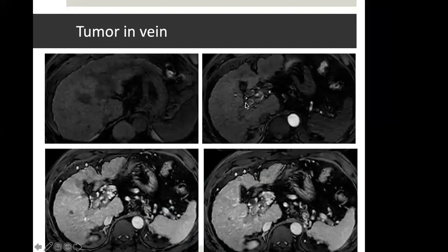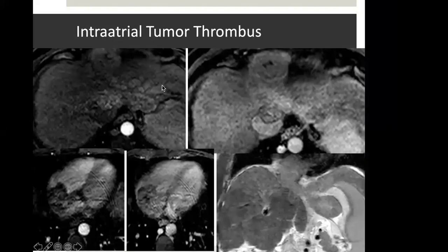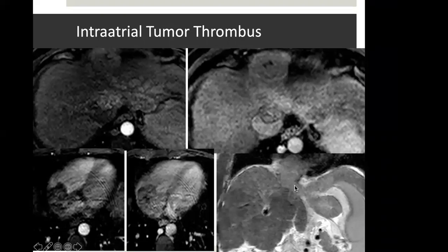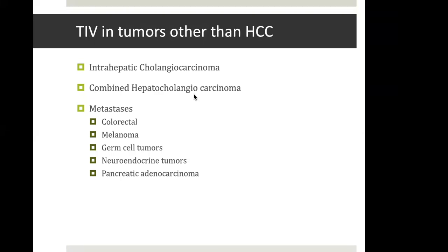When we are lucky, we get nice post-contrast images showing an expanded vein with enhancing soft tissue and multiple arteries within the expanded venous lumen. Sometimes tumor in vein can be very aggressive — in one case there was a diffuse tumor in the left lobe with tumor in the left hepatic vein extending into the IVC and then into the right atrium. This particular case was treated successfully with SBRT and ablation therapy. Tumor in vein, although most commonly seen with HCC, is not synonymous with HCC — it may also be seen with intrahepatic cholangiocarcinoma, combined hepato-cholangiocarcinoma, or some metastases.